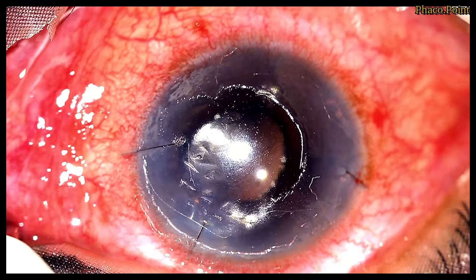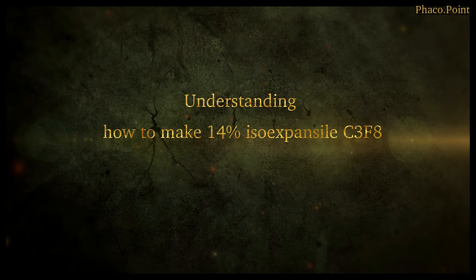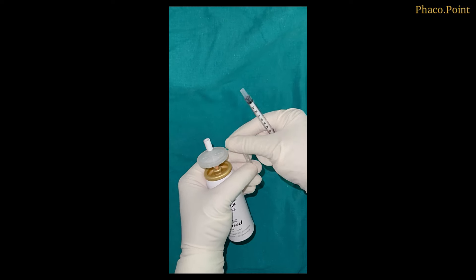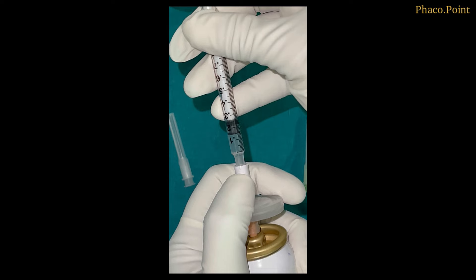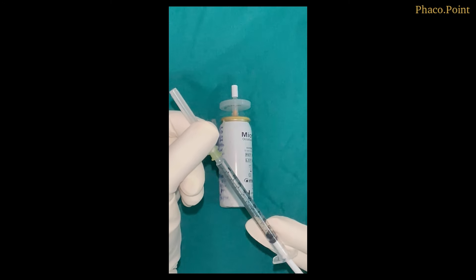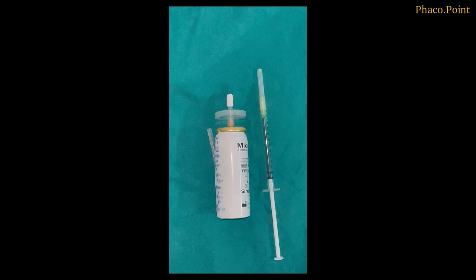With this we come to the end of this surgical case, wherein we've performed a pneumatic desmetopexy using 14% C3F8. To understand how to make the correct composition: what we require is 14% C3F8. Connect a 1ml syringe to the container containing C3F8 and draw out 0.14ml. Then withdraw the plunger to make it 1ml — this gives you the required concentration of 14% C3F8. We are now ready to inject the C3F8 to achieve a pneumatic desmetopexy with gas.